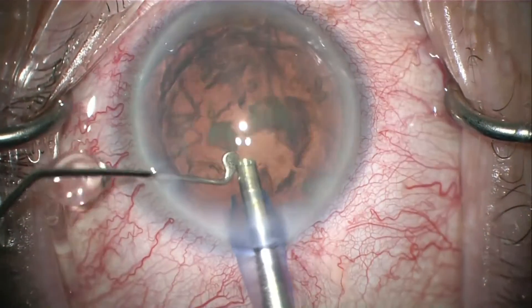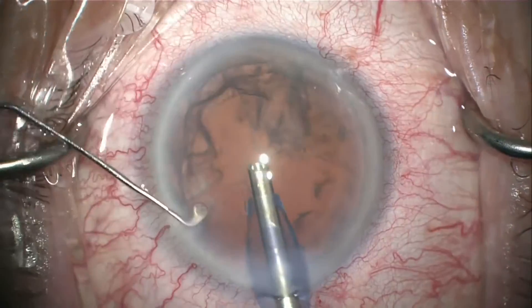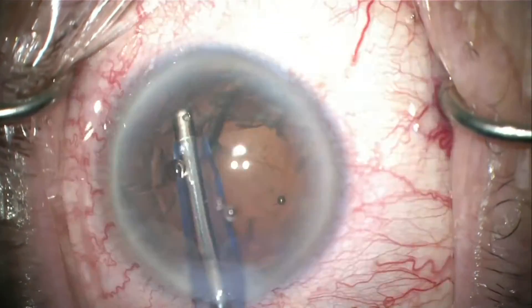At the same time you can notice the very exquisite control within the anterior chamber, with no movement to the posterior capsule or any shallowing.